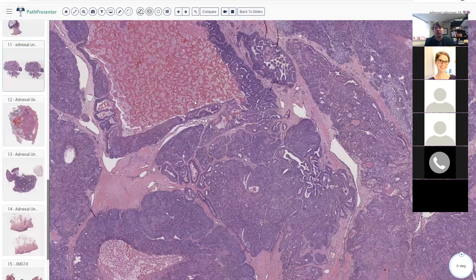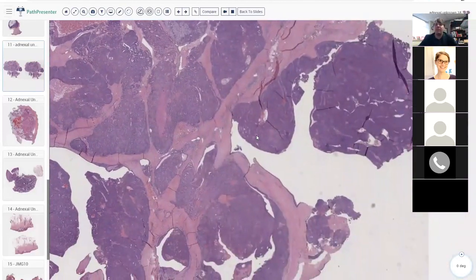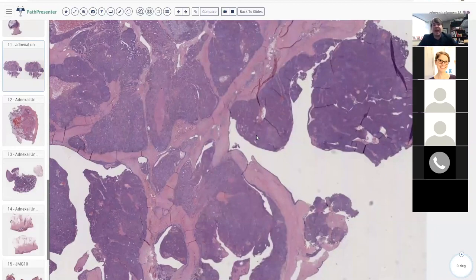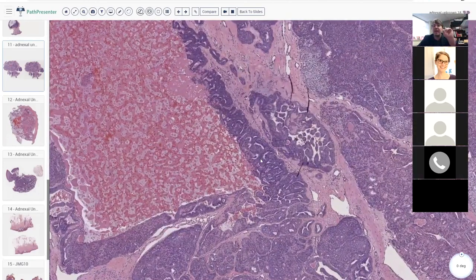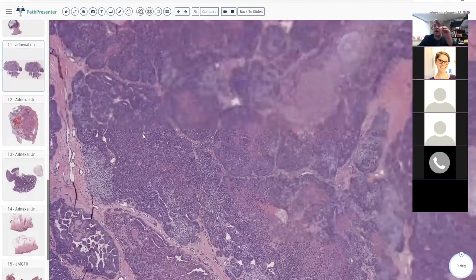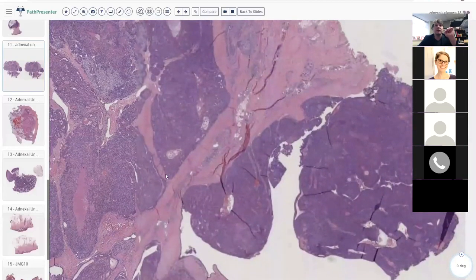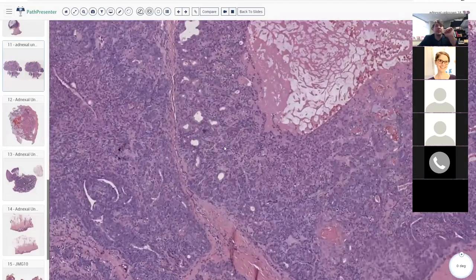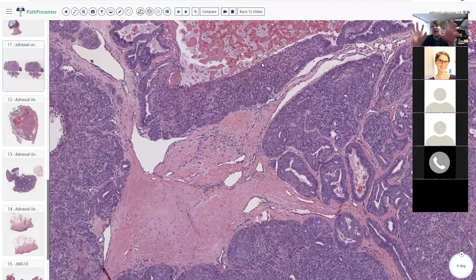This is a really important entity to know. It's relatively rare, but it usually doesn't look particularly malignant. Cytologically it's often bland — I've seen exceptions with marked atypia and necrosis, but the majority of cases are bland and benign-looking. In fact, many are nicely circumscribed, almost encapsulated-looking cystic lesions with papillae or micropapillae and solid areas punctuated by little tubules. That's the classic combination to make this diagnosis.